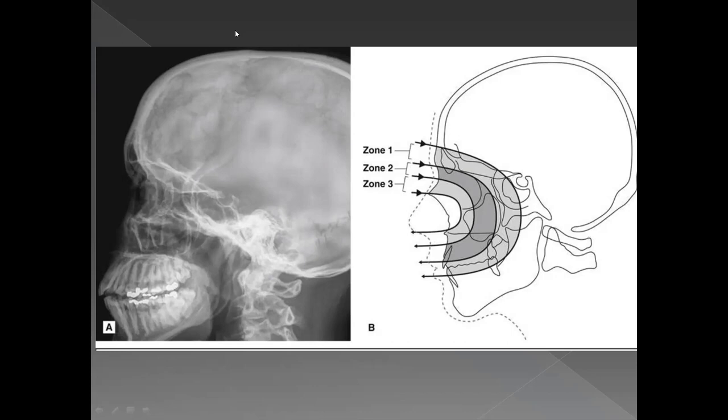Yes, if it is non-displaced, then it probably will be difficult to see. But if you can send us a picture of that in the group, then probably we can see. It was a bony window. Well, then probably again, since it was non-displaced, that is the reason you were not able to see it. And this is one thing that you will always see written on a CT report, that clinical correlation is recommended.